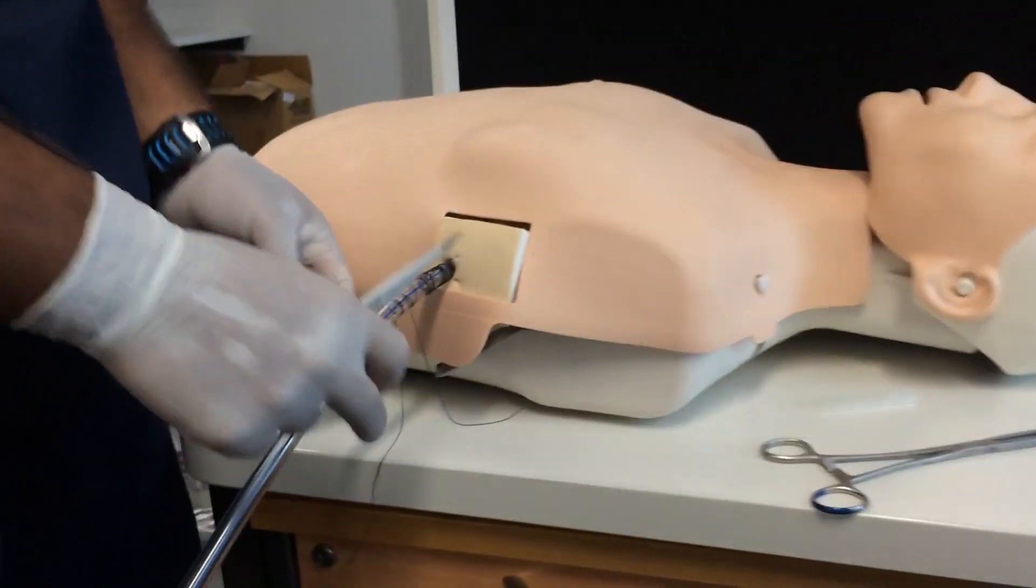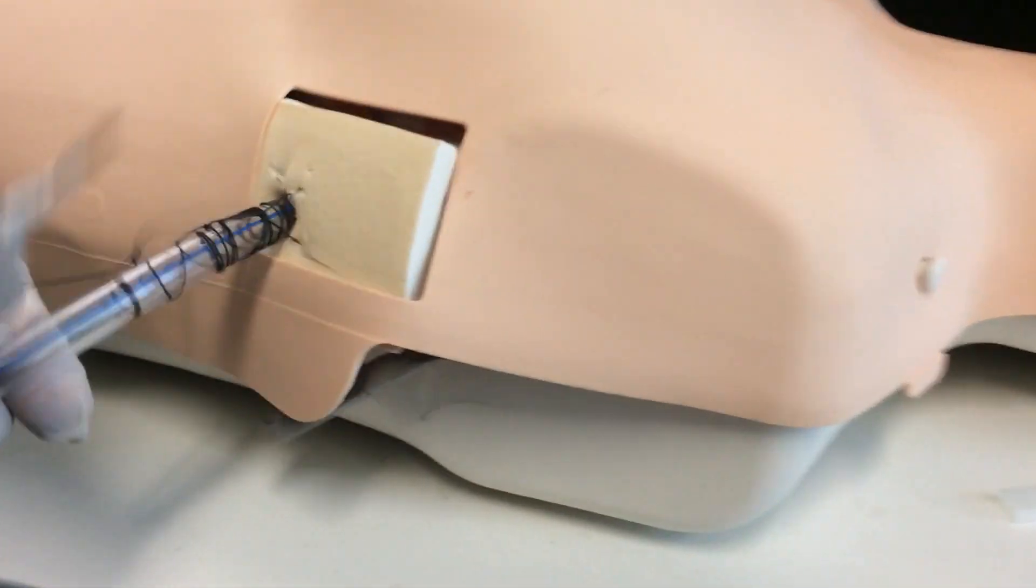And then when the ward take the drain out, you cut.